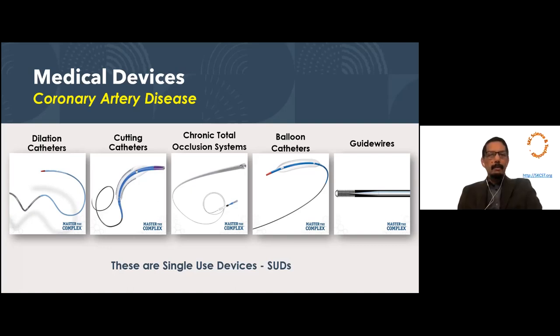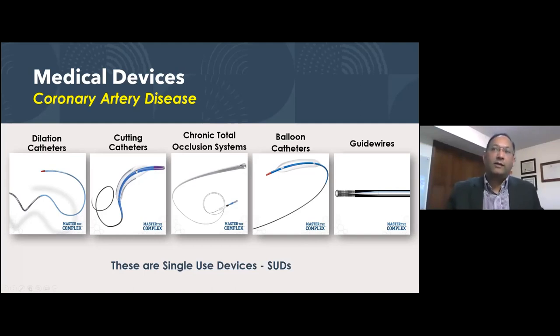It looks simple here, but there's a number of parts that go in that have high precision in order to be assembled into a small catheter. And catheters are measured in a unit called French. These can be 3 French, all the way up to 12, 13. The unit French is a very old terminology. It comes from the size of the veins. So based on the size of the vein, you make different sizes of these catheters for different locations of the body.